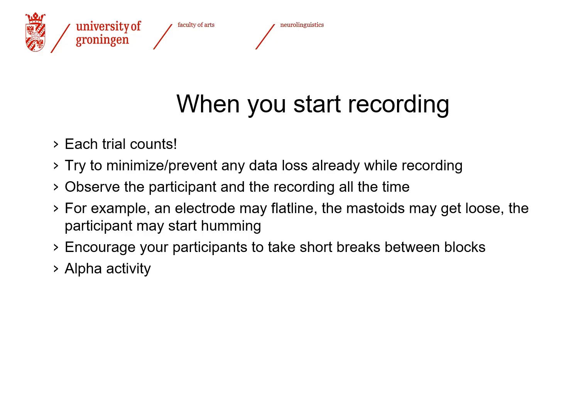Why am I saying this? Well, you may see some things that can actually be repaired even while recording is in progress. You may see that an electrode is flatlining, and then you may be able to fix it, maybe even during the recording or during a break. Or you may notice that your participant has started humming and you want to alert them and tell them not to do that.